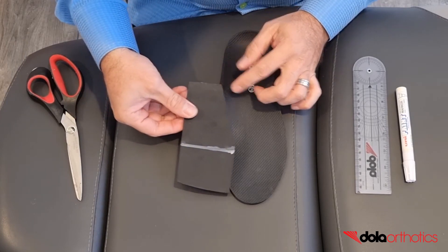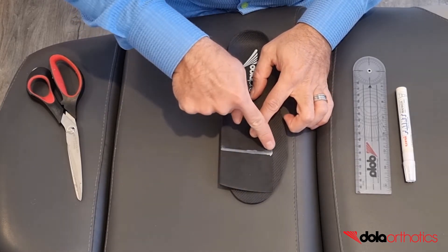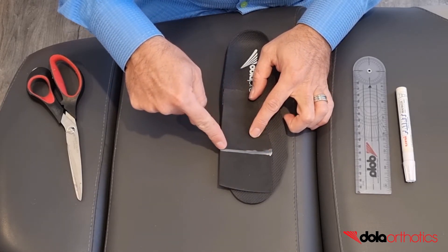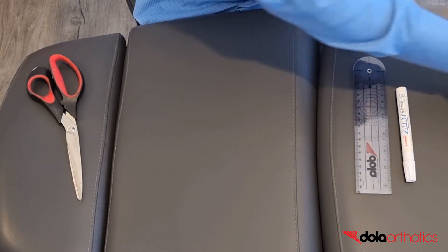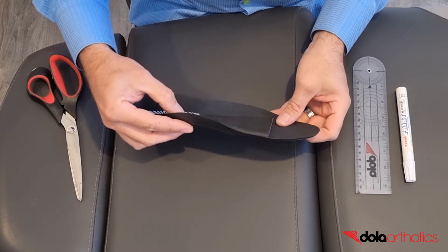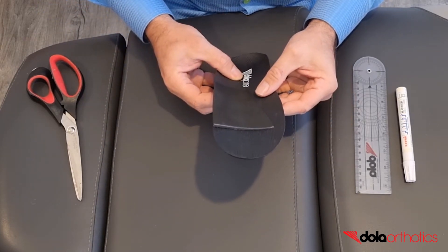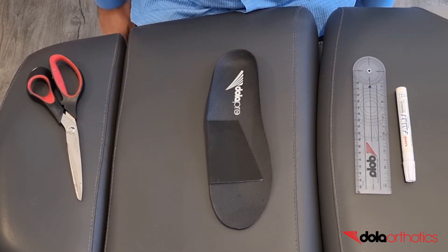For dorsal application, start the proximal end of the wedge blending with the arch and extending under metatarsals 1-4. Mark the distal end at the required length to sulcus or beyond and trim with scissors. Using the self-adhesive 3M backing, place on the dorsal surface with the wedge thicker medially and cover for dispense.